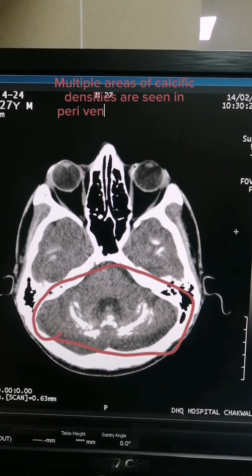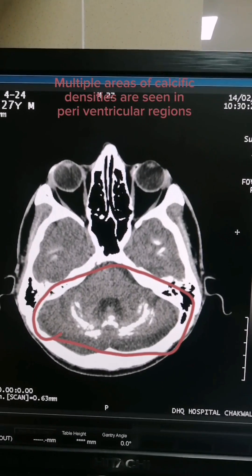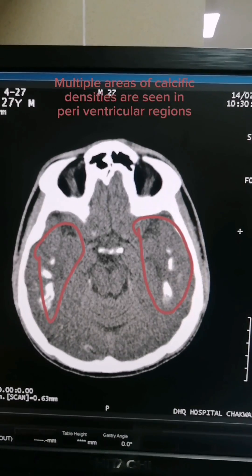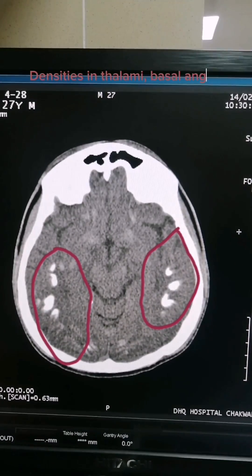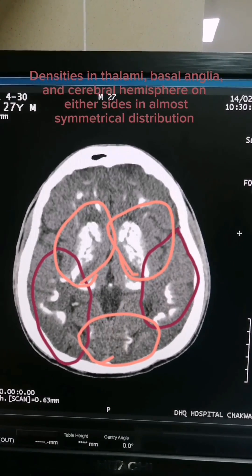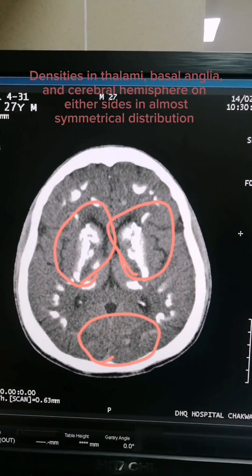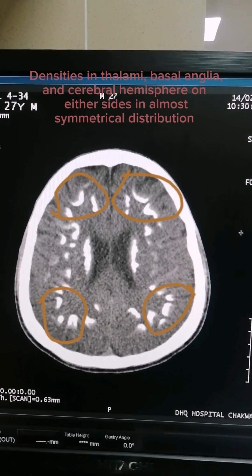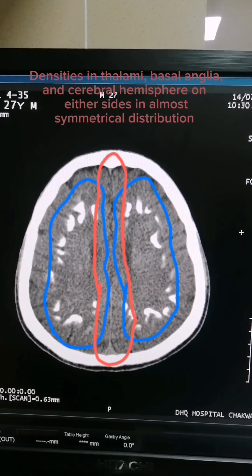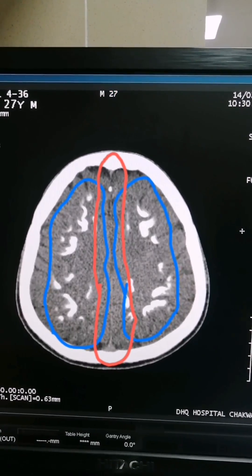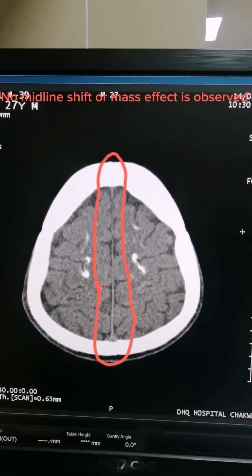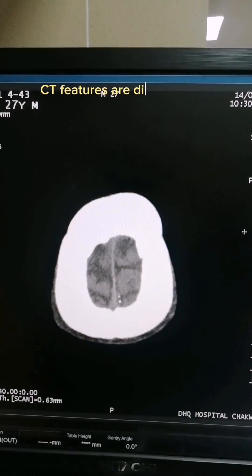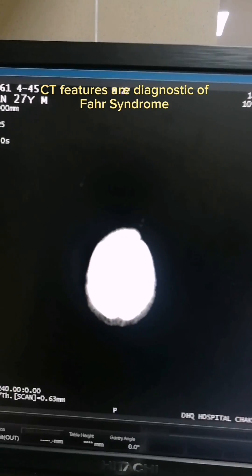Multiple areas of calcific densities are seen in periventricular regions, densities in thalami, basal ganglia, and cerebral hemispheres on either side, in almost symmetrical distribution. No midline shift or mass effect is observed. CT features are diagnostic of Fahr syndrome.